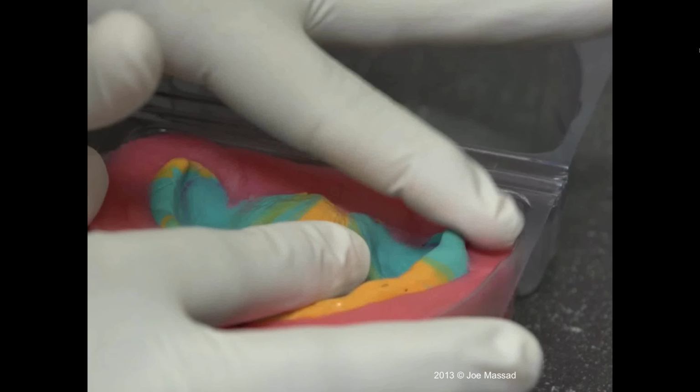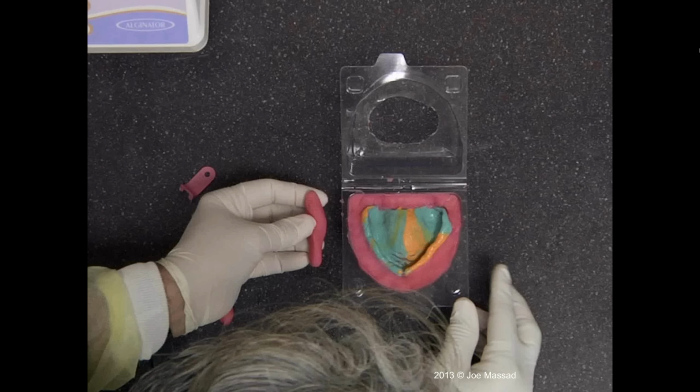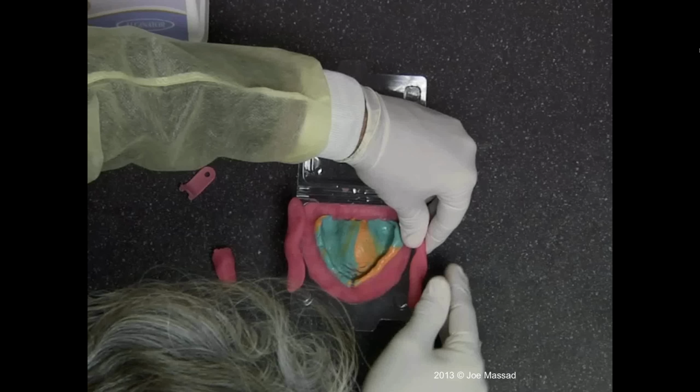Now, you see, I didn't get enough material, so I've got to do something like this to make sure I have an excess. Because if you don't, I assure you, you're going to be frustrated because you pour the liquid in, it will just all come out the sides. So I need a little extra here.